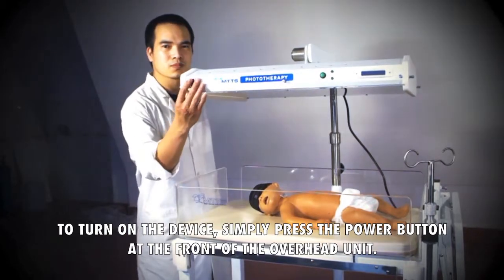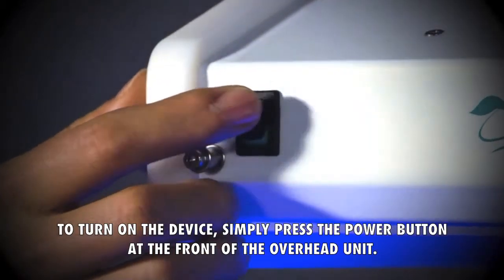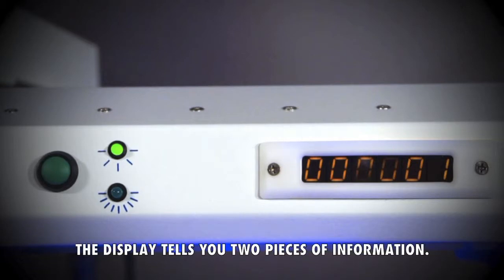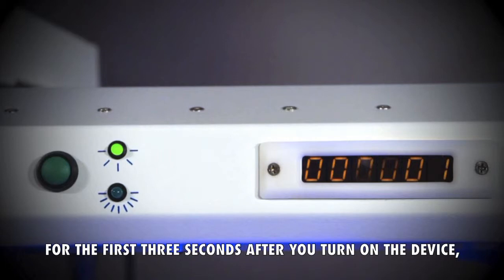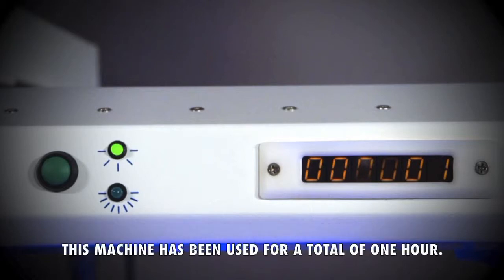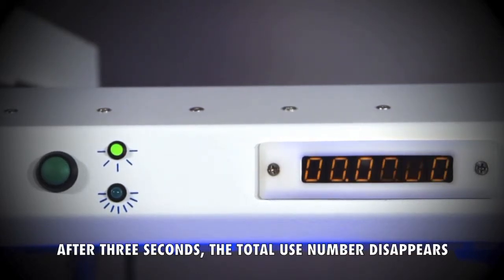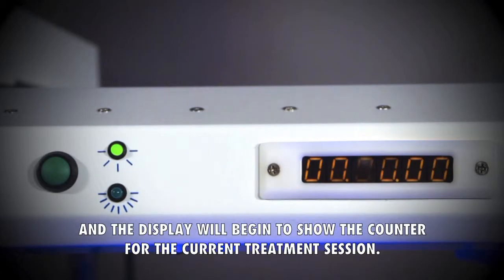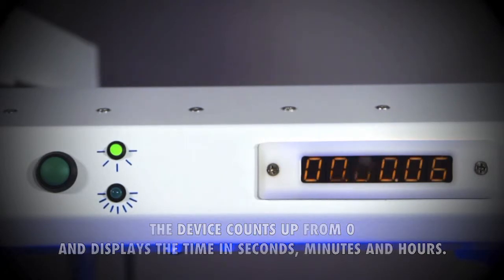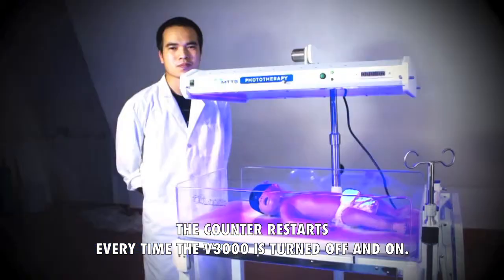To turn on the device, simply press the power button at the front of the overhead unit. When the device is on, the display screen will light up. For the first three seconds after you turn on the device, the display will indicate the number of hours that the V3000 has been used since its manufacture. After three seconds, the total use number disappears and the display will begin to show the counter for the current treatment session. The device counts up from zero and displays the time in seconds, minutes and hours. The counter restarts every time the V3000 is turned off and on.